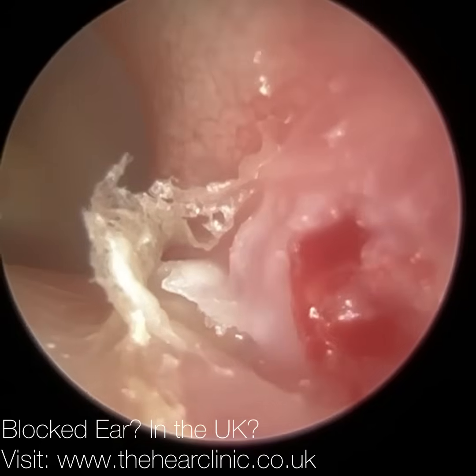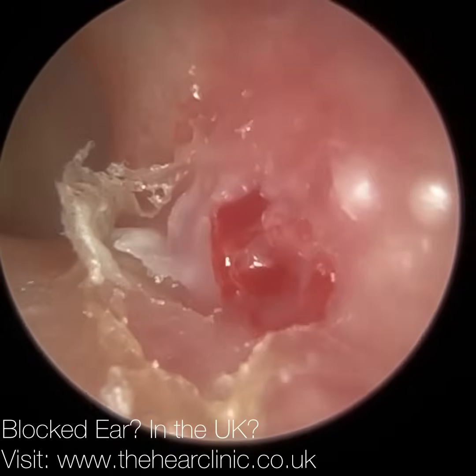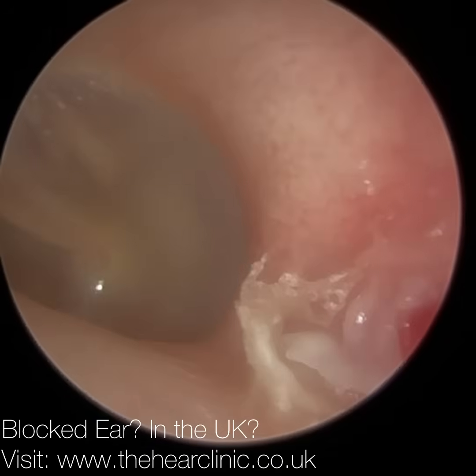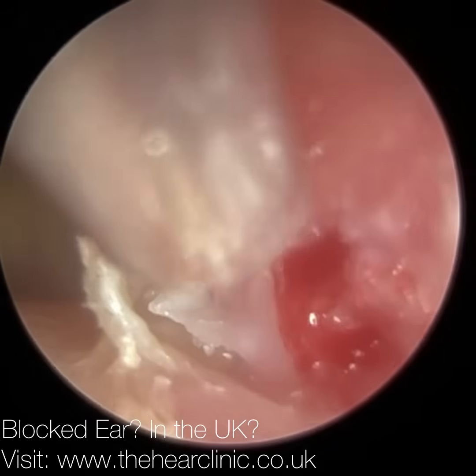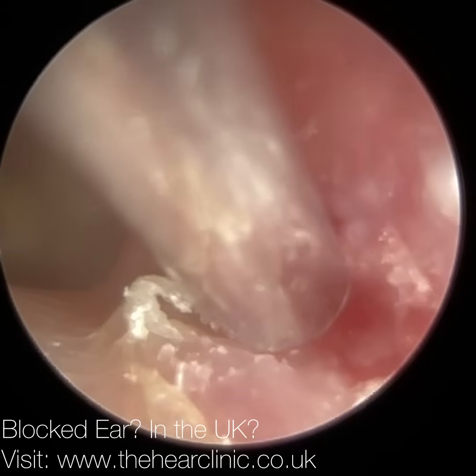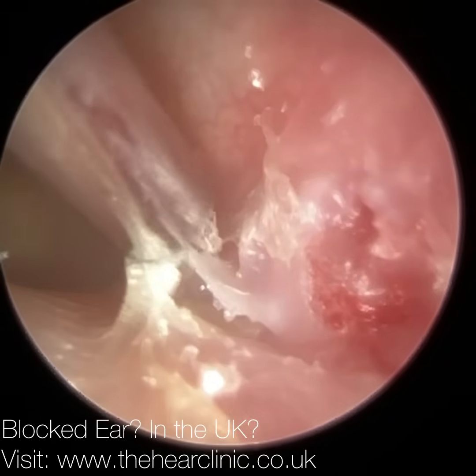So I've just mopped this region up, peeled some of the adjacent crusted skin away, and sent this patient to the GP in the first instance because there's no visible site of exposed bone. But this patient will need some anti-inflammatories, some steroid drops — typically dexamethasone is given — and some antibiotics.